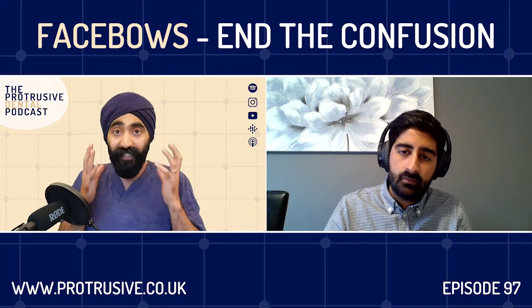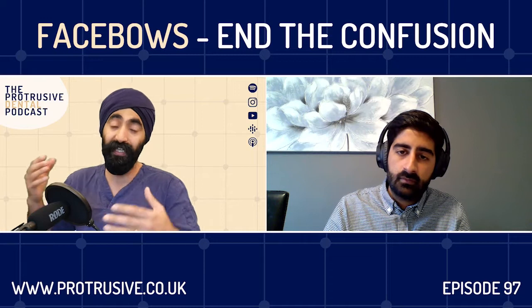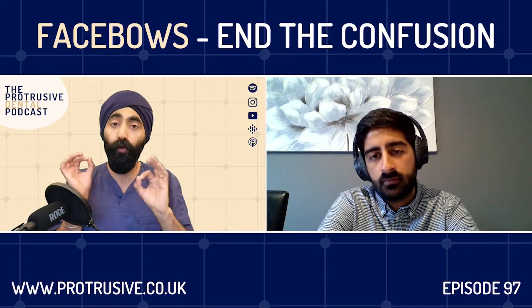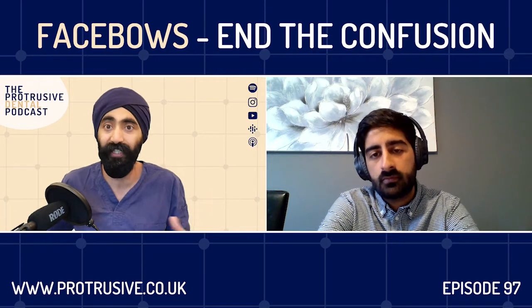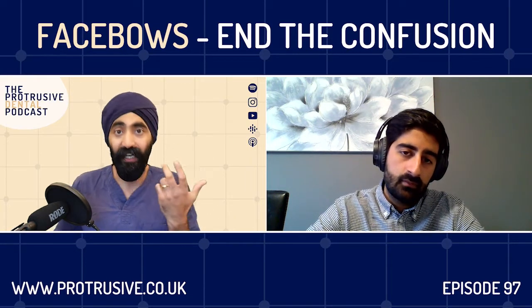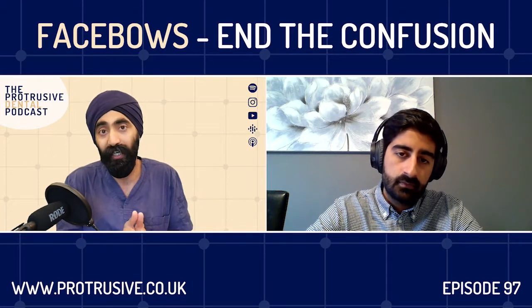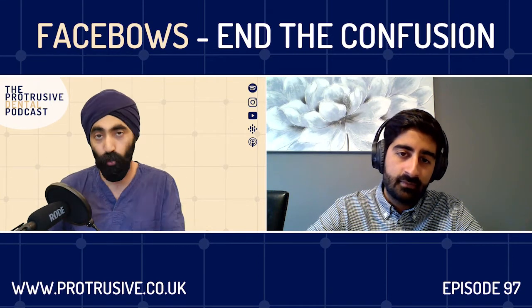And then by doing complex work, and therefore having to use Facebows and articulators, you're probably going to be having a temporary phase. Now, this temporary phase could be in composite, in temporary crowns, or a combination of both, and that is the time you work on it, you nail it, you dial it in, you do your adjustments, you do your equilibrations within your temporaries, because that's what we're doing essentially. We are equilibrating temporaries, and then you hit the nail on the head where you said, in the future, when we're ready, when we've tested it in the environment, the human articulator of that patient, we then get the technician to copy the features. I think that is as good as it gets, and it negates the need for any fully adjustable articulator, would you say?